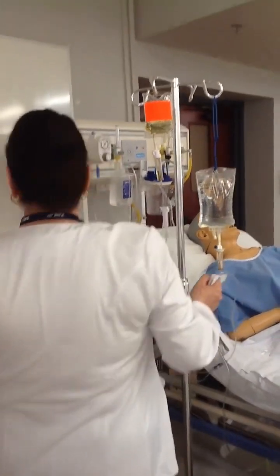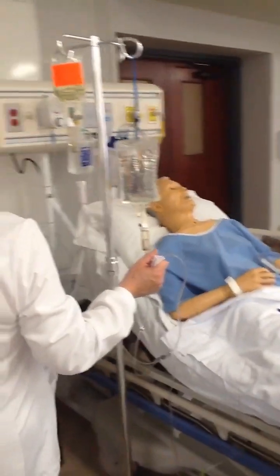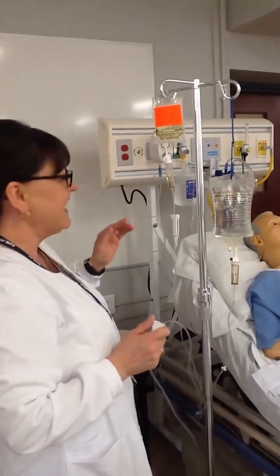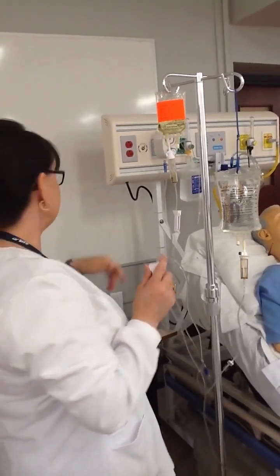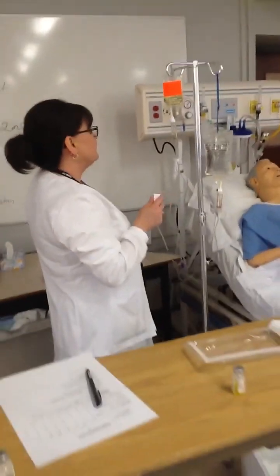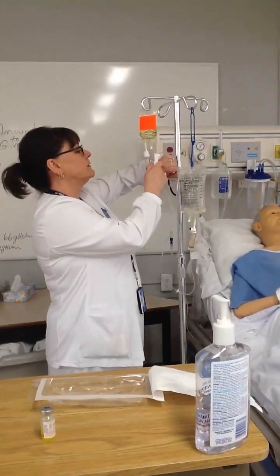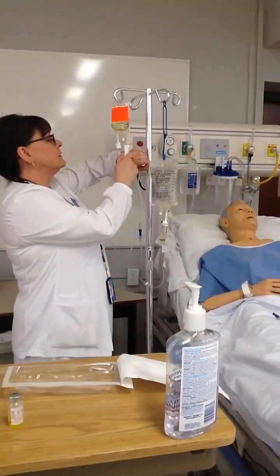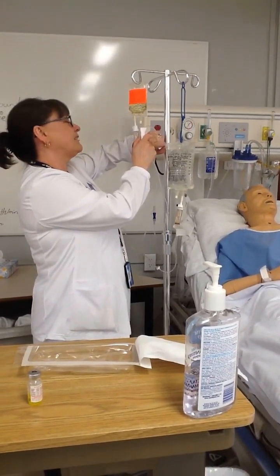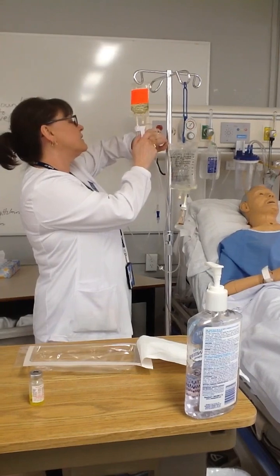So we know we need 17 drops per minute, and that's going to give us an infusion time of 50 mils in 45 minutes, sorry. So I'm going to divide that and simplify it myself. I'm going to count for 15 seconds. I'm going to try and get around 5 drops in every 15 seconds.